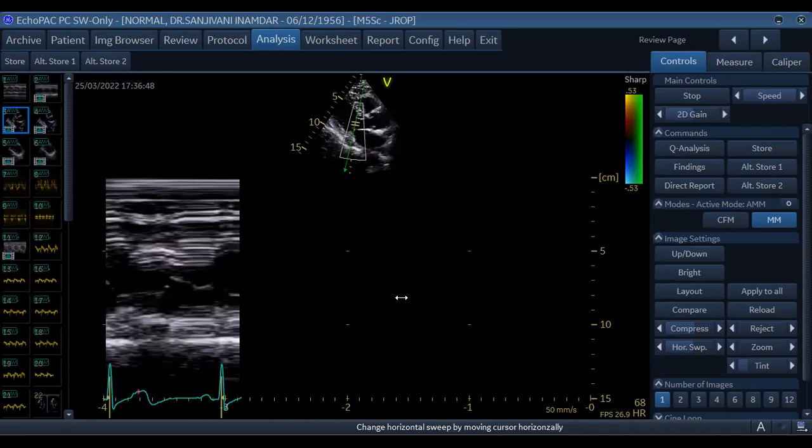Okay. If this is what you're looking for, this is known as EF slope. Can you see the left side of my arrow? This is EF slope. Yes, sir. Anyway, think over it again and I'll get back to you. That's not an issue.